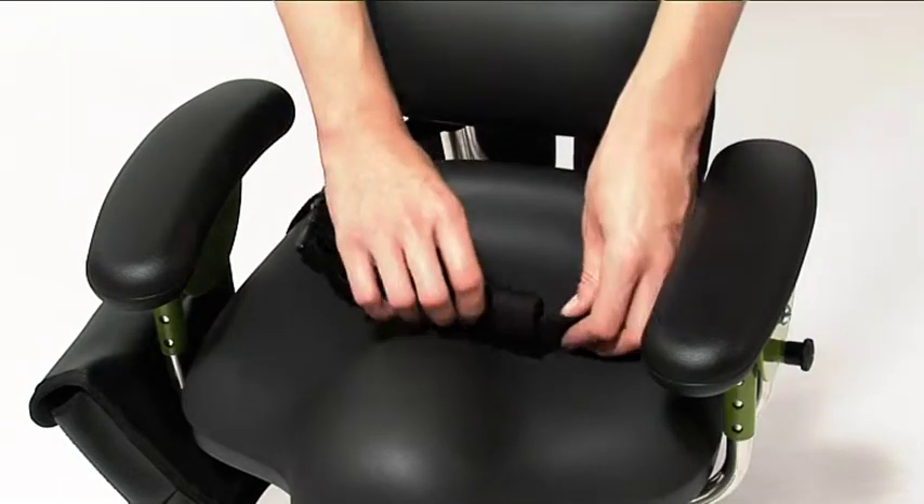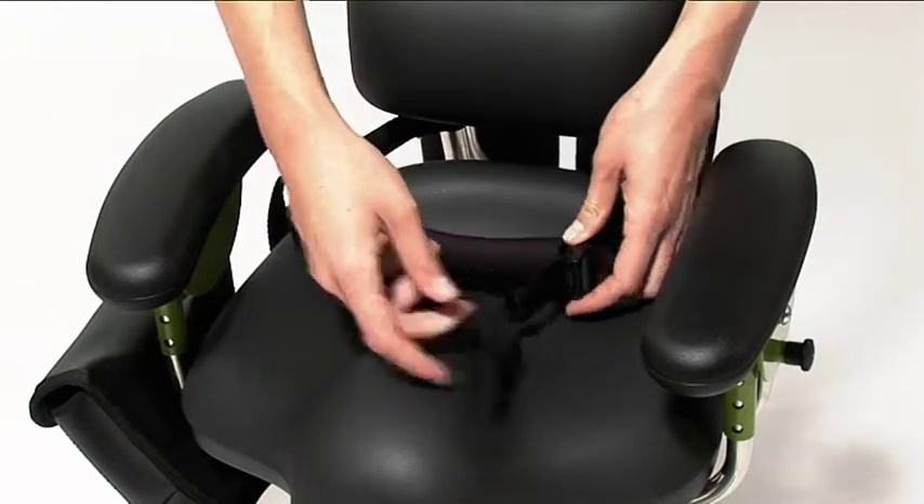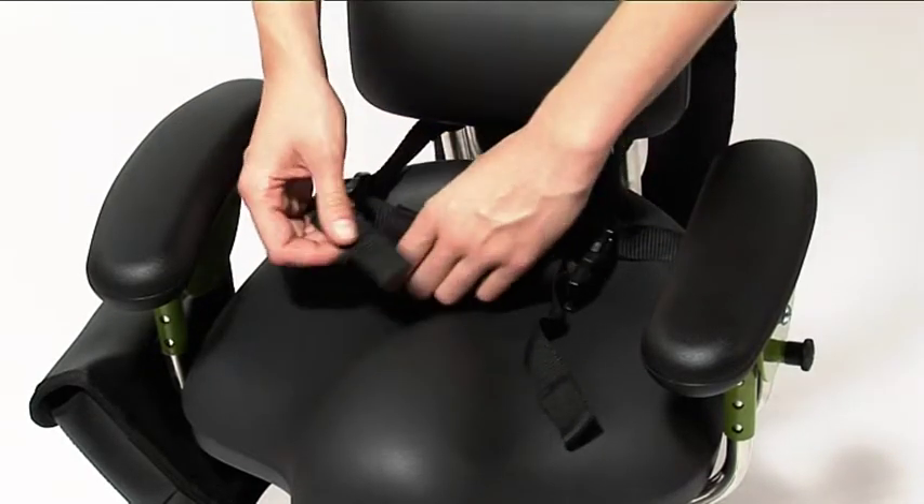To adjust the pelvic strap, release either clip. Adjust the strap to the desired length, then reconnect the clip.